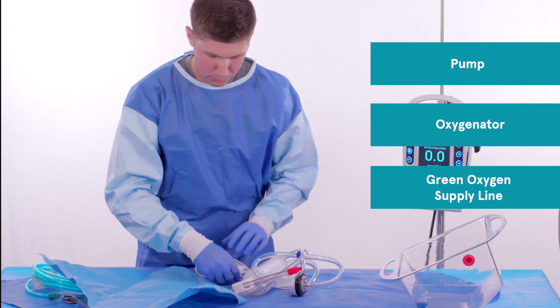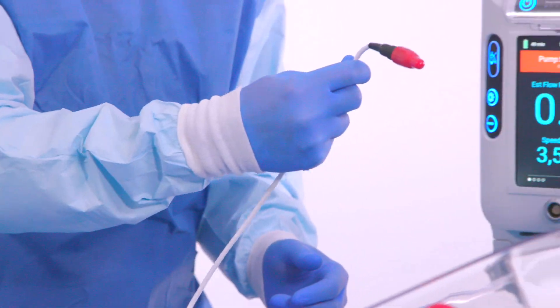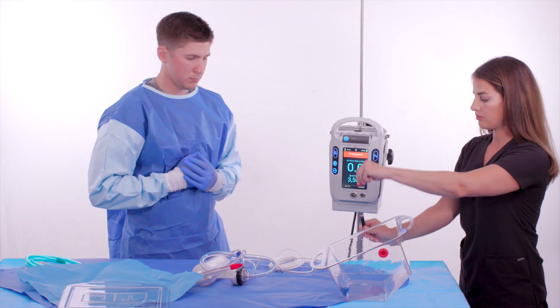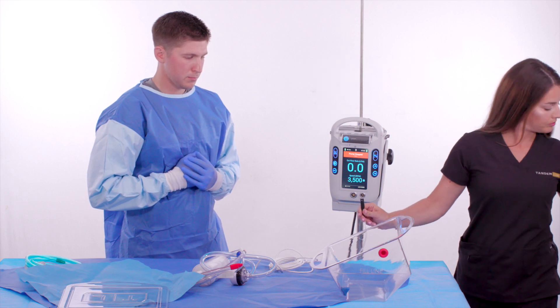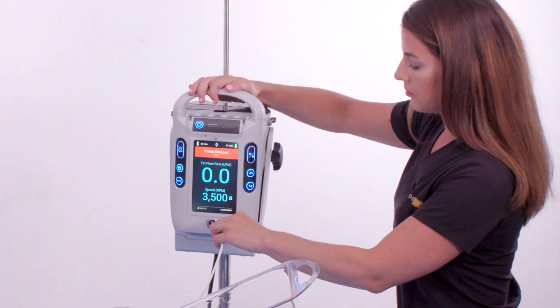Next, the sterile operator hands the pump power drive line to the non-sterile operator. The non-sterile operator removes the red protective cap and connects the pump drive line to the pump receptacle located below the controller user interface.